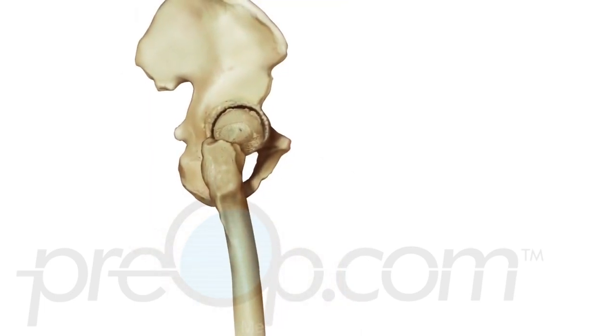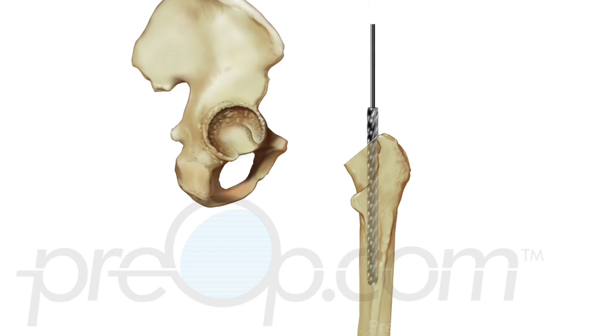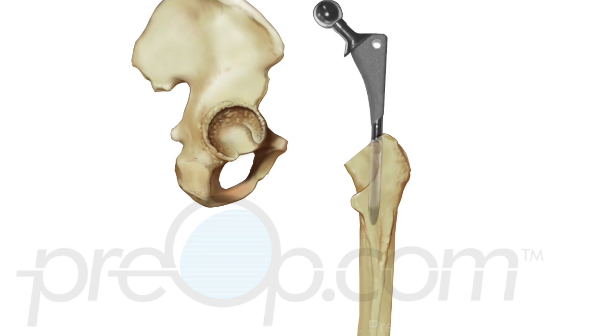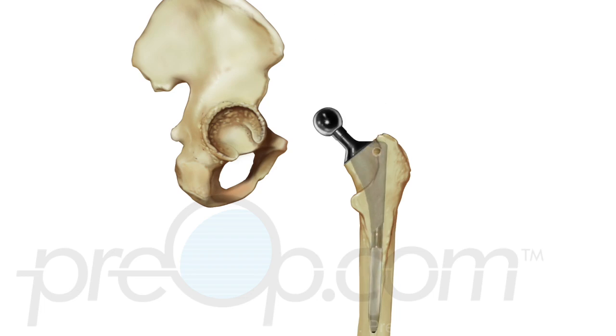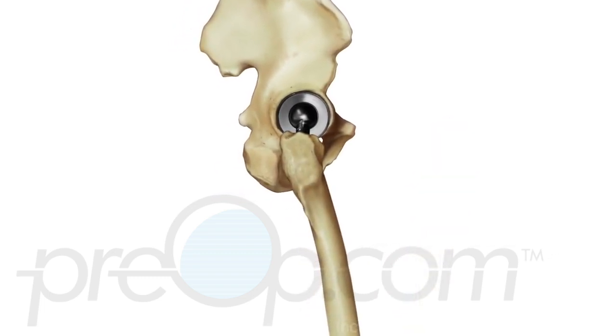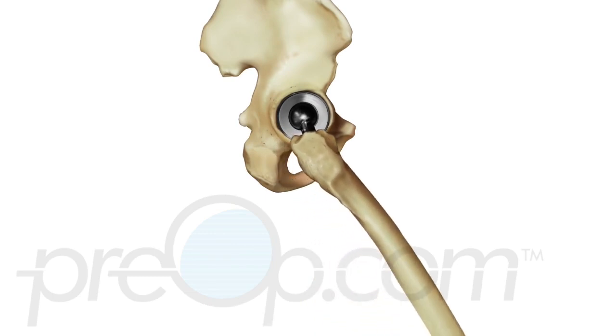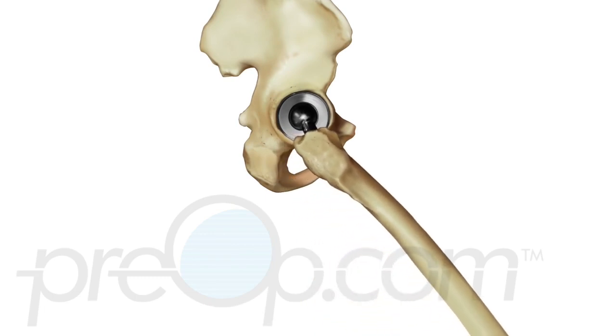The damaged femur head is lifted from the socket. The head is cut off of the femur bone. A hole is drilled in the top of the femur to hold the ball implant. The replacement piece is fitted and put into position. Next, the hip socket is smoothed and the matching cup implant is fixed to the surface. The ball and socket implants are brought together and tested to be sure the joint fits correctly and moves well.